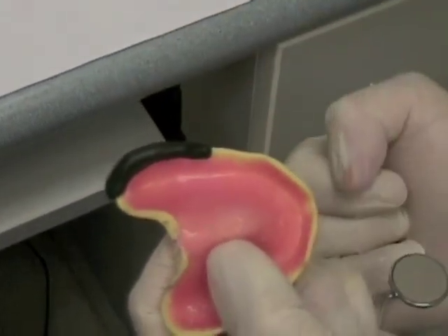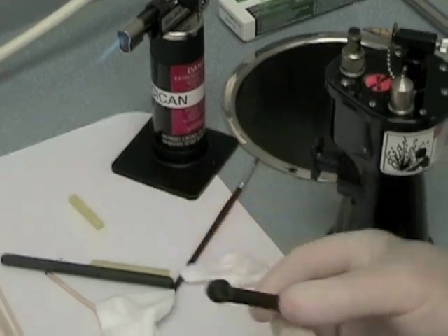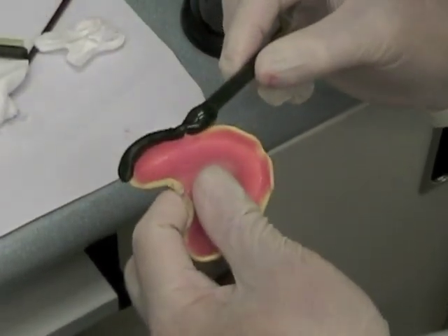If the compound has properly touched the vestibular tissues, it will lose the gloss and look matte like it does here. Once you have one segment molded, you can add additional compound and move along to the next segment of the tray.